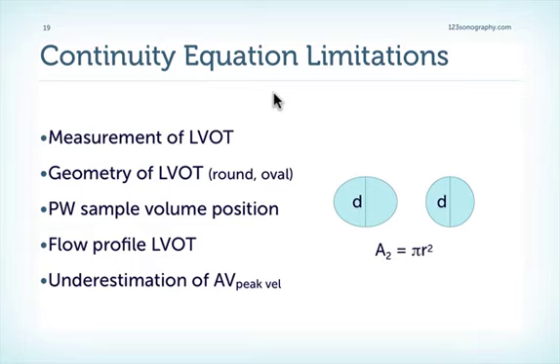Then we don't always know where we have the PW sample volume in the LVOT. It might not be the same as where the diameter was taken in the parasternal view. The flow profile in the LVOT, of course, is very important, because if you have, for example, aortic regurgitation or turbulences in a hypertrophic septum or in hypertrophic obstruction in the LVOT, then we can have a wrong measurement of the LVOT velocity. And finally, it's very important to remember to use several windows to get the highest AV peak velocity, so that we don't underestimate the velocity and get a wrong, in this case too high, aortic valve area.